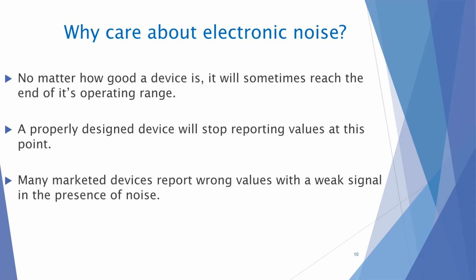When they first introduced the technology, it happened a lot, but now it happens really infrequently. But what causes the problem? What causes the problem is when you combine dark skin and low perfusion, you cause pulse oximeters to struggle far more than they do in general.